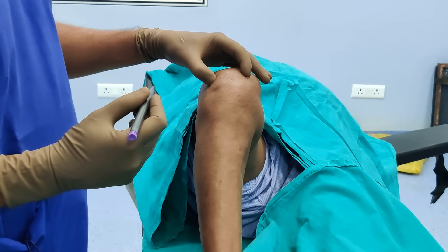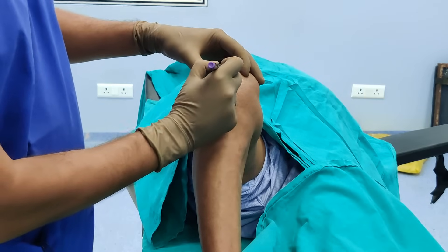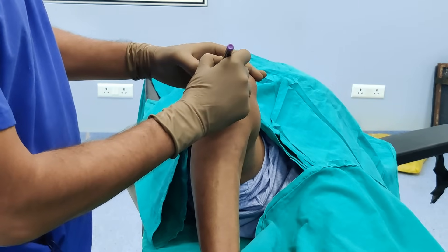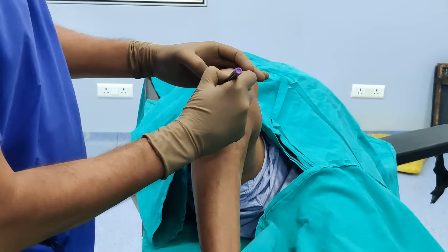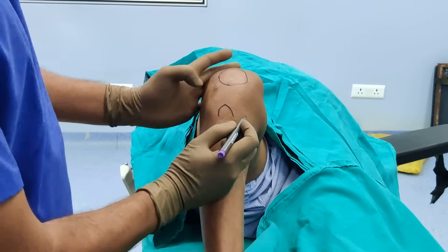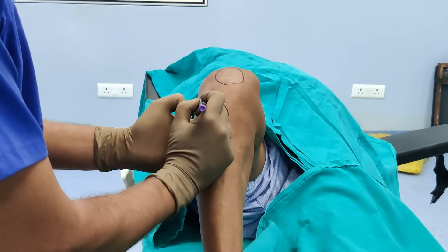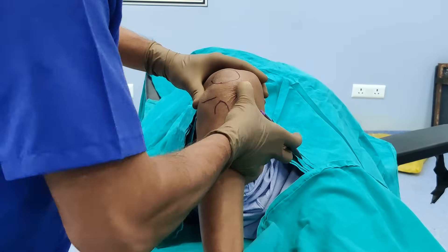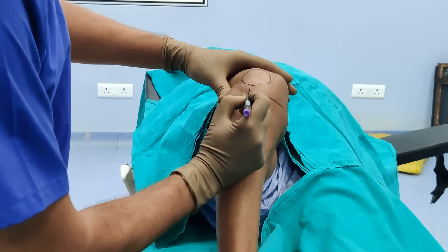In order to do this injection, you need to be aware of certain landmarks. I am just going to draw the patella — feel for the inferior pole, feel for the superior pole. So this is our patella. You can see the tibial tuberosity — it is there. Feel for the joint line. This is the lateral tibial plateau and same here the medial tibial plateau. This is the patella tendon.